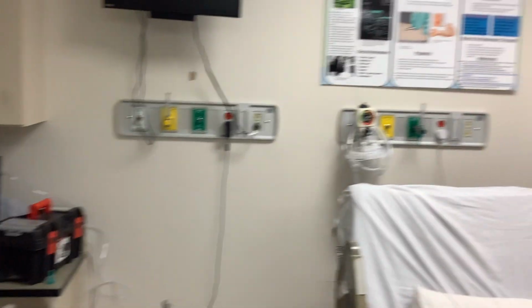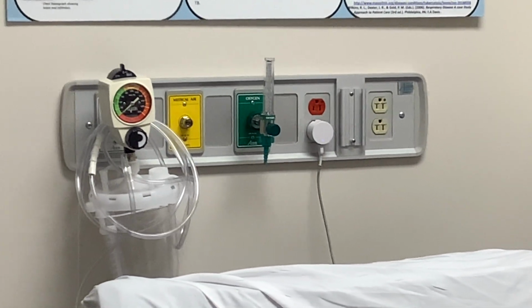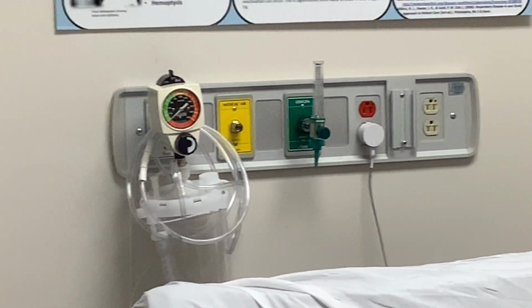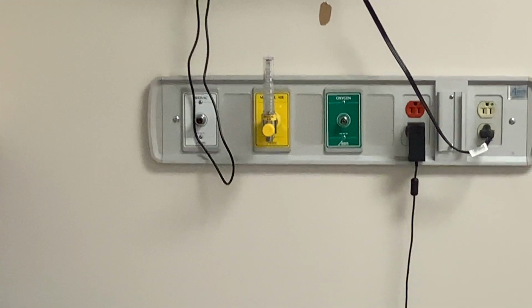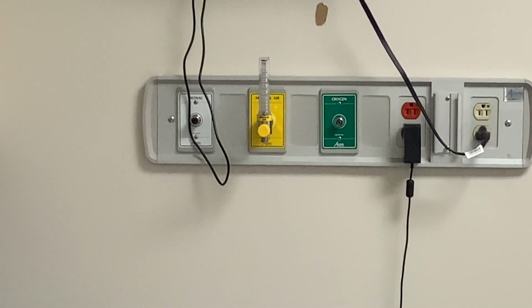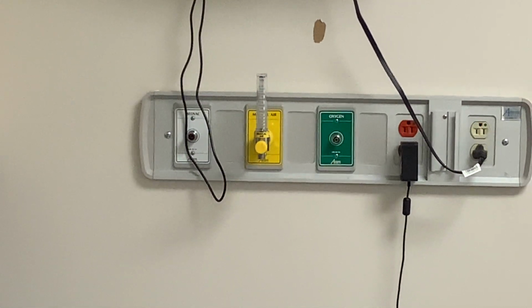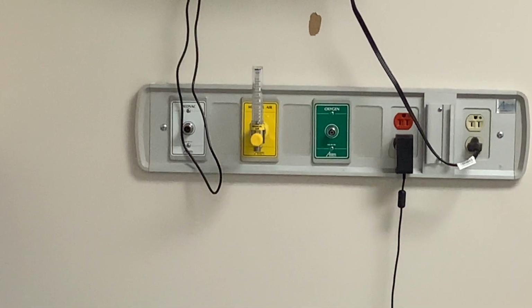So the amount of oxygen that comes out of the wall, if you're utilizing an oxygen flow meter, is going to be 100%. And you can gauge that at 1 liter, 2 liter, 3 liter, 4 liter, and so on, up to the calibrated value of 15 liters. If you're utilizing a medical grade air flow meter, the amount of oxygen that comes out of the wall is 21%, because that's the same air that you and I are breathing. 0.21 would be the FiO2 associated with room air.